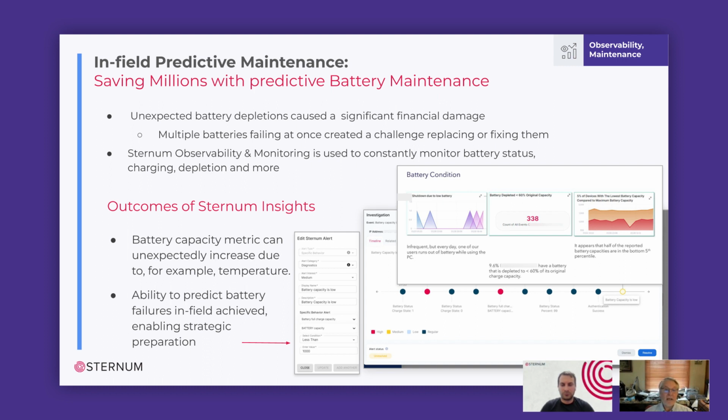And so we had an unexpected problem after this product had been out in the field a number of years with the battery failure rate ramping up to a level that was very difficult to manage. And in that product, we had no way of knowing that was coming. And so on the product I worked on here with the same kind of battery in it, I added observability tracing so that we can keep tabs on the health of the battery.